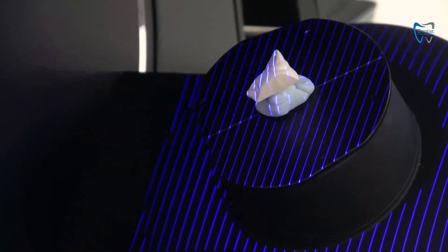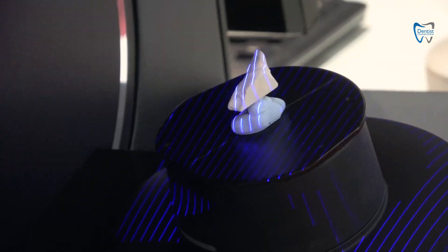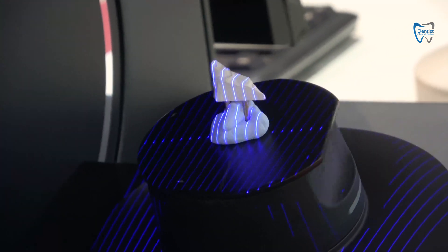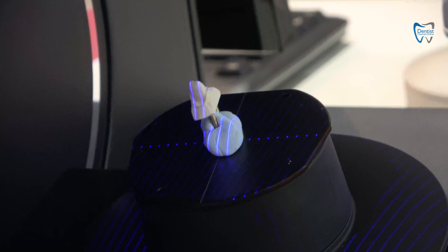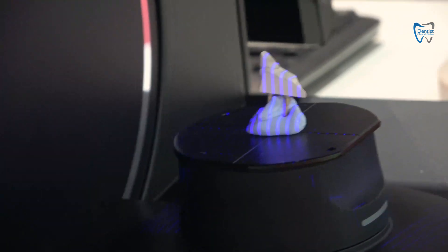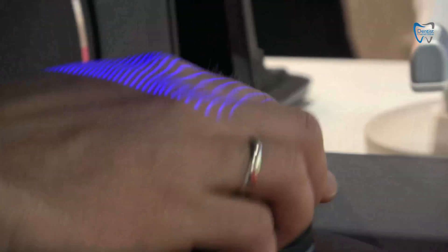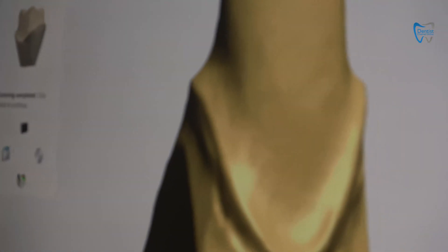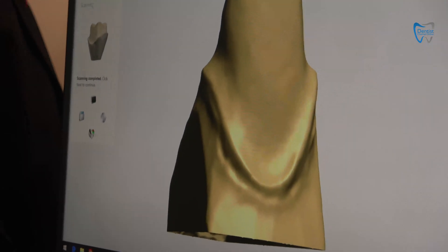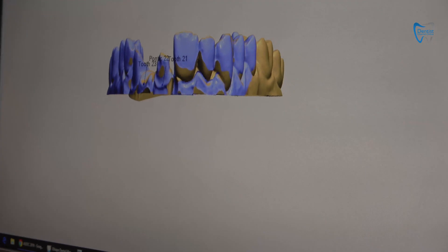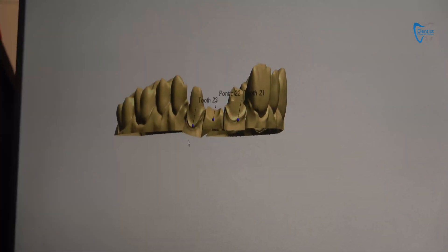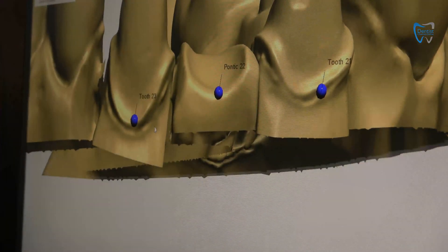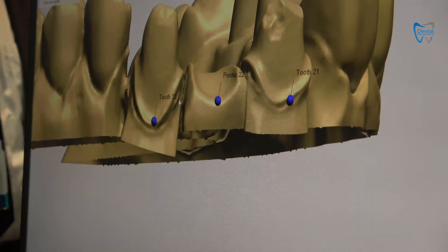Automatic alignment of the CBCT and the intraoral scanner. And the difference 0.00. So very, very good alignment. And we can see that we have this same number fitted all around. If it's not all around, we need to adjust it maybe manually to get it first. Because by the time it doesn't fit. On the very last step, you as a user, you can analyze the quality of alignment and the quality of each die.